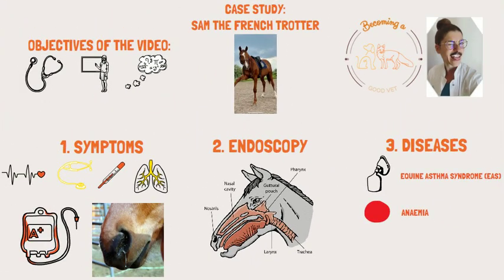To settle a reliable diagnosis during the endoscopy, bronchoalveolar lavage had been performed. This permits investigating disease of the lower respiratory tract by analyzing the cells present in the part of the respiratory tract. Moreover, blood samples had been collected to analyze and underline any disorder like lack of red blood cells, numerous leukocytes, etc.